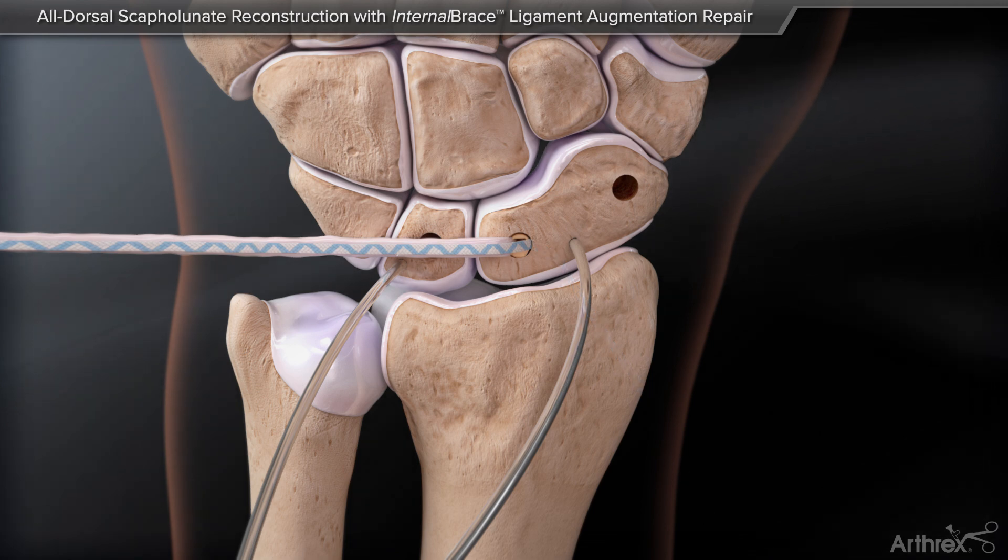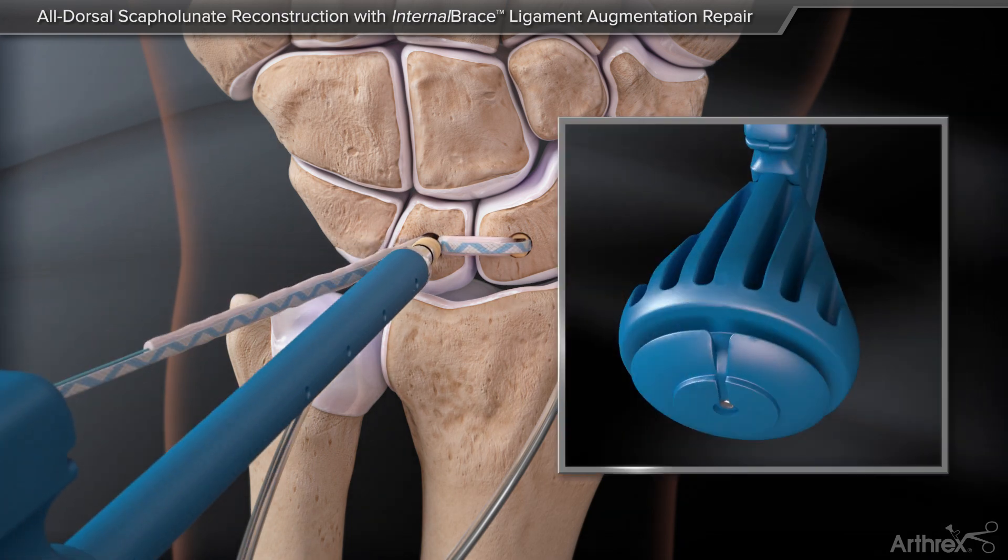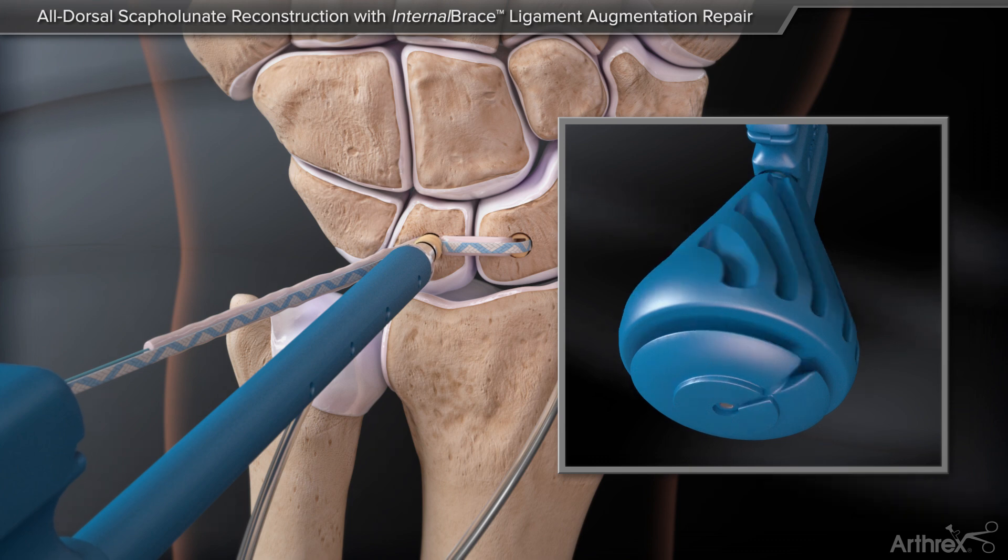The second swivel lock captures the graft and one limb of the suture tape suture. The anchor and graft construct are inserted into the lunate.